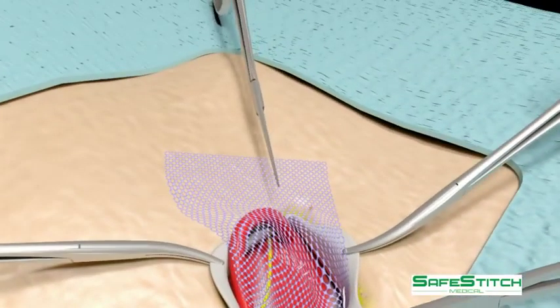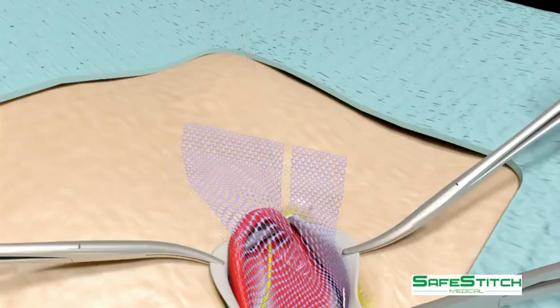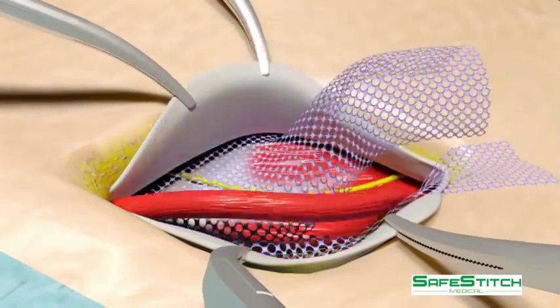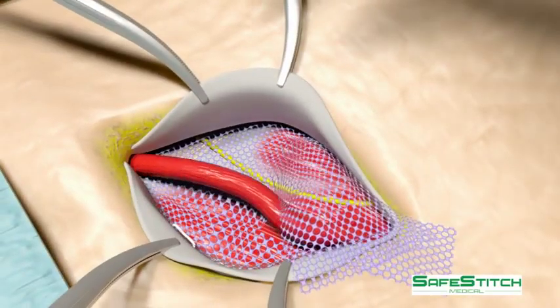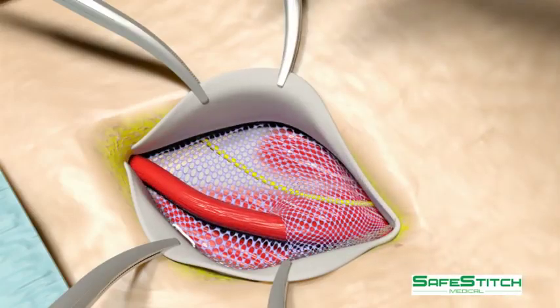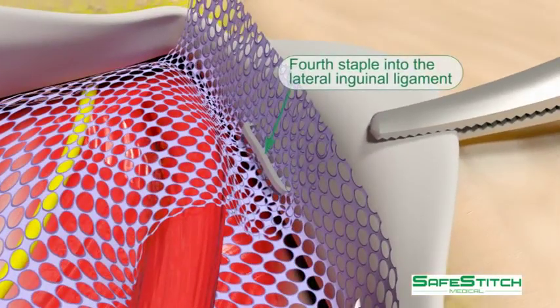The mesh is cut creating two tails. The top tail is placed under the spermatic cord. The stapler is used to staple the bottom edge of the upper and lower tails to the inguinal ligament. Here you see the fourth staple.